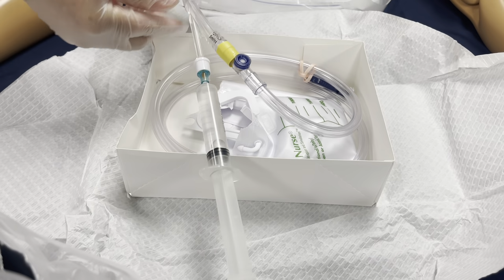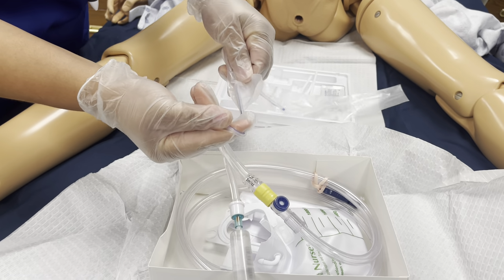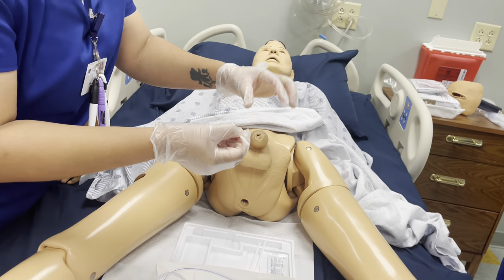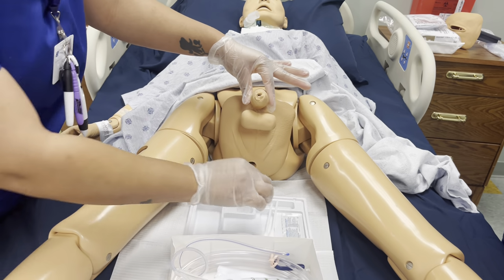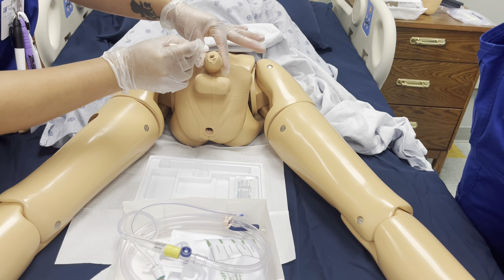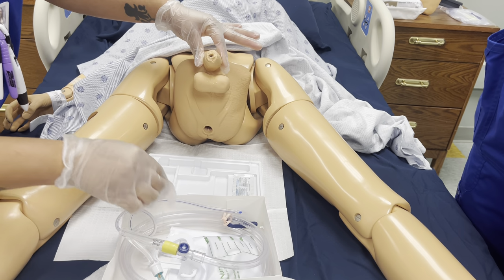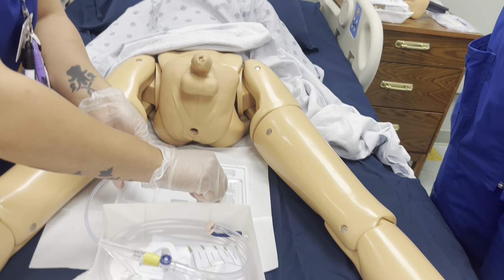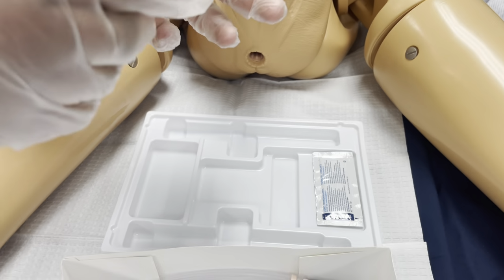Now that's done. Now I'm going to take my paper off of the lube that goes inside. I'm going to wrap my fingers, you see it, right? All the way out. Clean back. Wipe, discard. Wipe, discard. And then she went in the middle, right? Wipe, discard. Now I'm going to get my piece and lube it really well, y'all. It isn't open right now. My lube. And I'm going to get ready to insert.